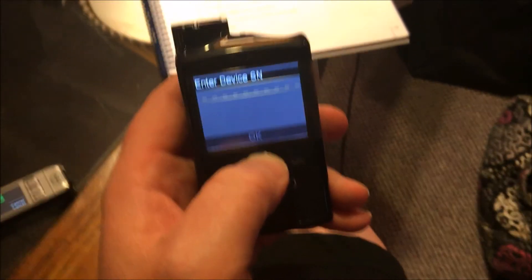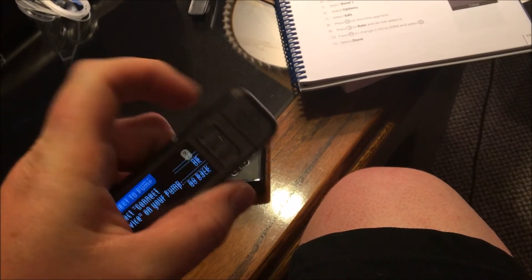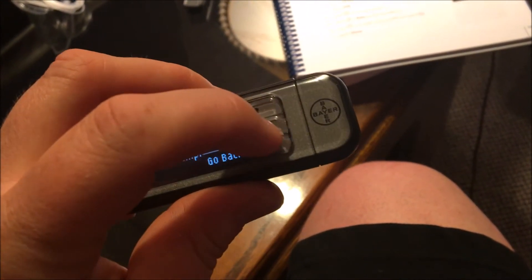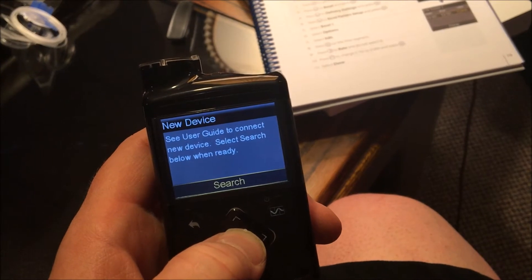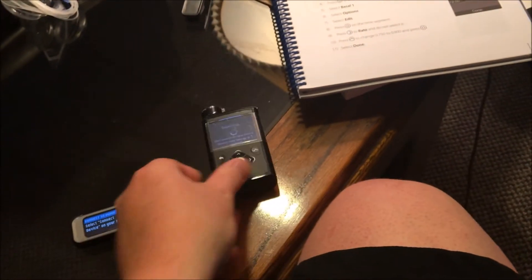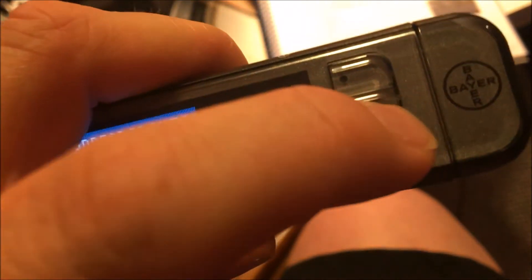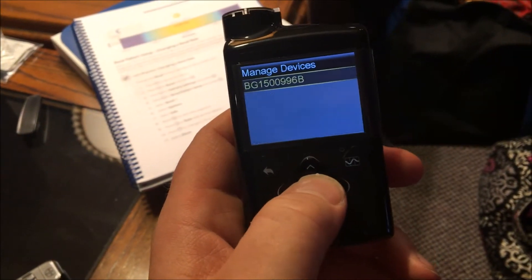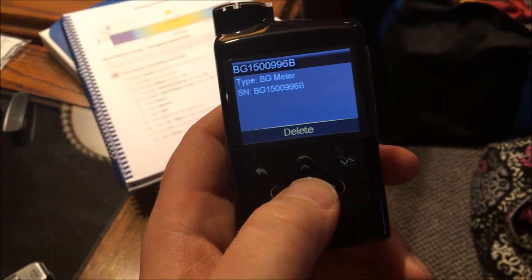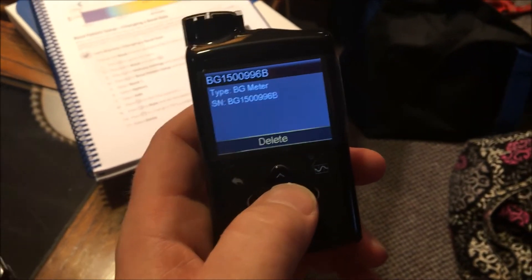On the meter it asks: do you want to connect to a MiniMed pump? I'm going to click OK. Select connect device on your pump — we'll do that. We'll go back to manual connect, hit OK, and we already have the number in. So we'll hit search — now they're both searching. It's in there! I got it to work that time. My camera died on my phone so it didn't capture the successful confirmation screen, but that's all you missed. It looks like we're good now.